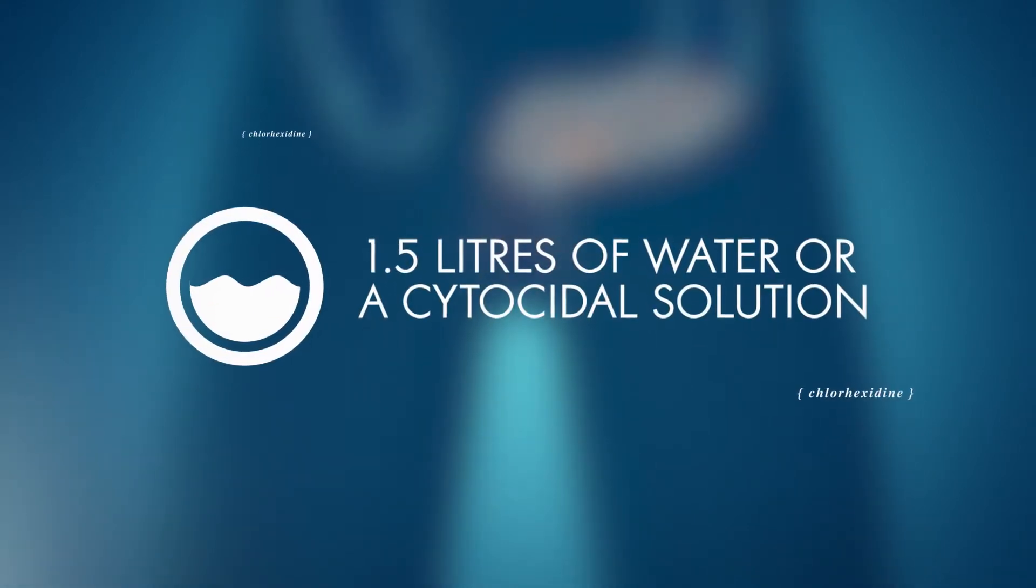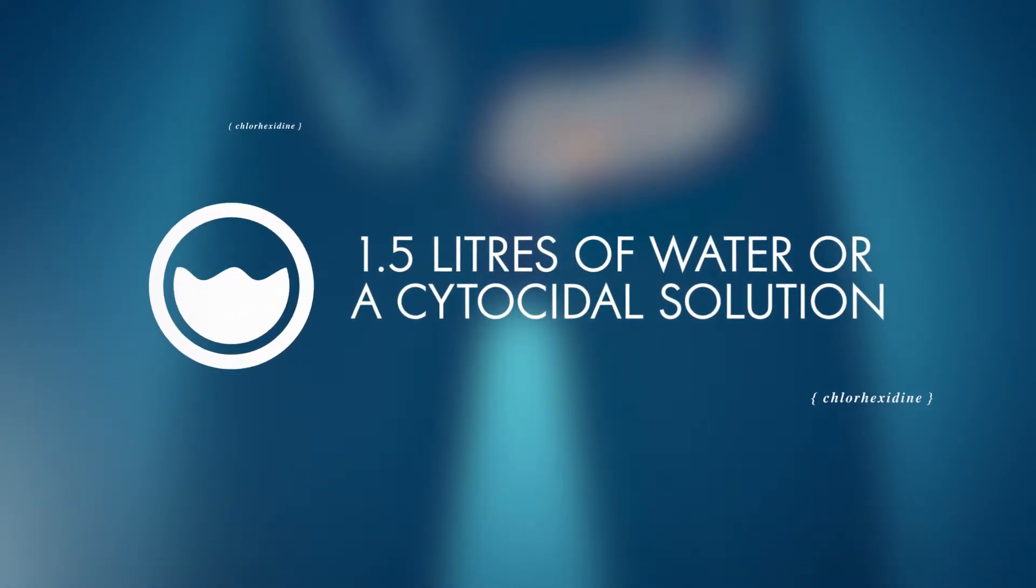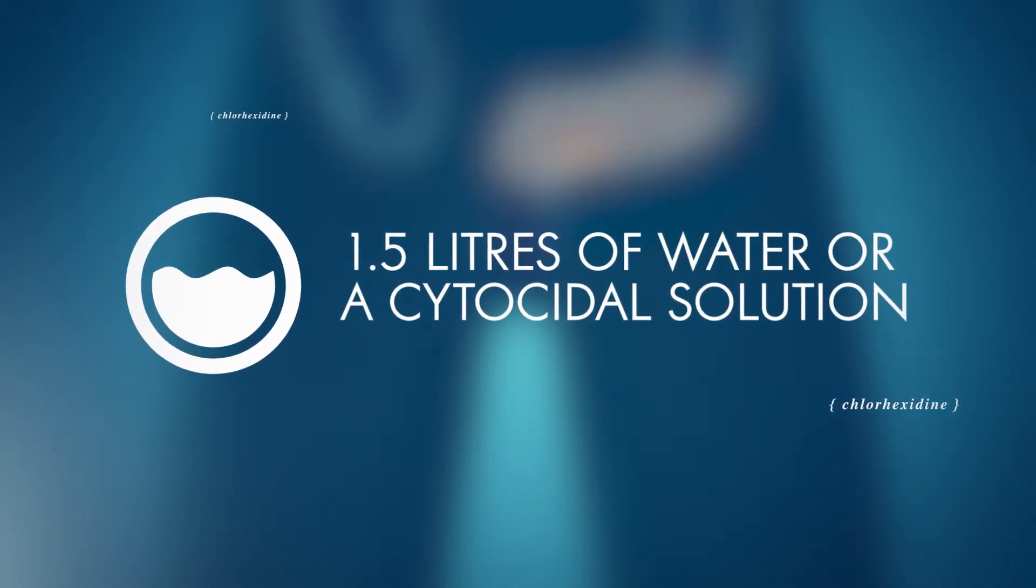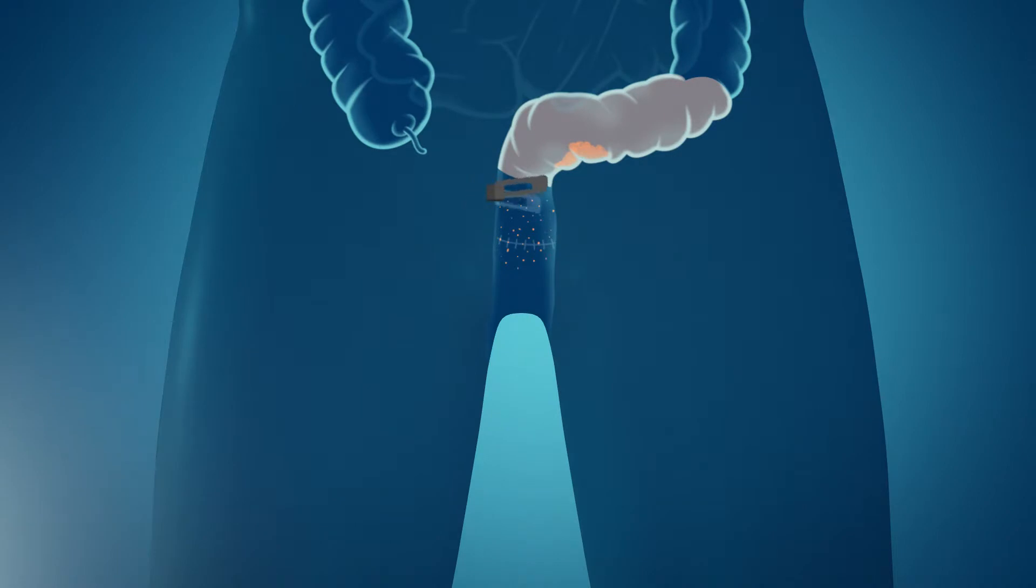A rectal washout with at least 1.5 litres of water or a cytocidal solution such as chlorhexidine has been shown to remove these cells. Typically, this is performed using a proctoscope or a Foley catheter, with the irrigation introduced by syringe, which has proven to reduce the rate of local recurrence.